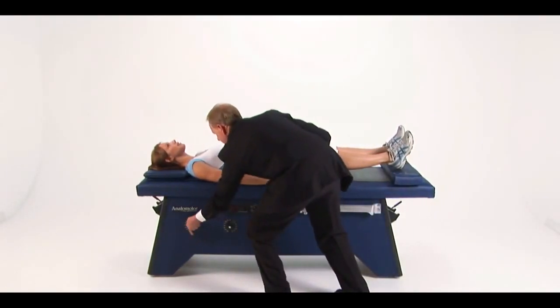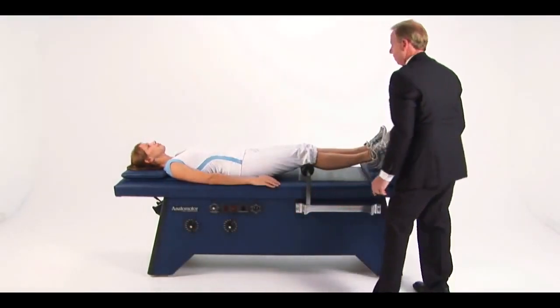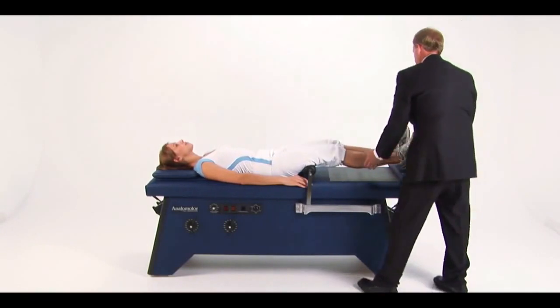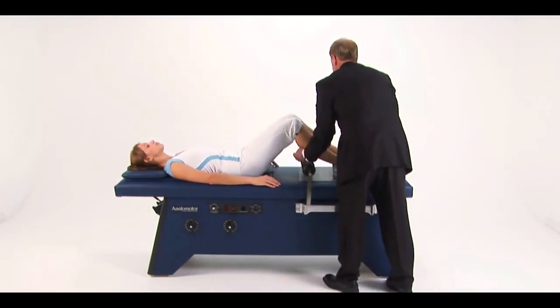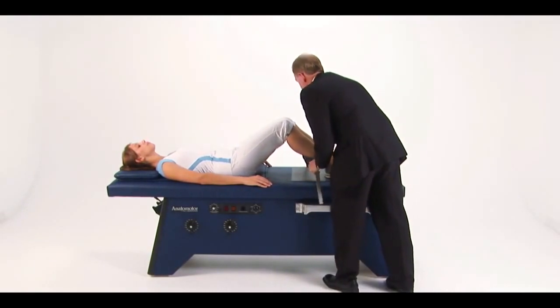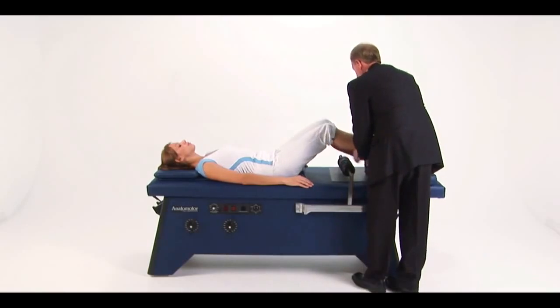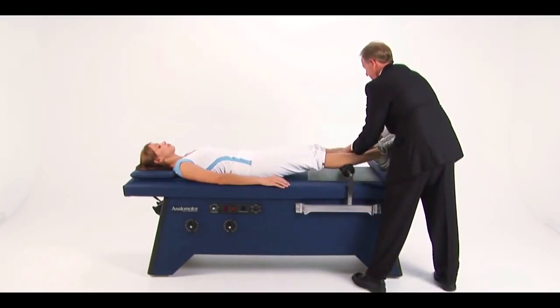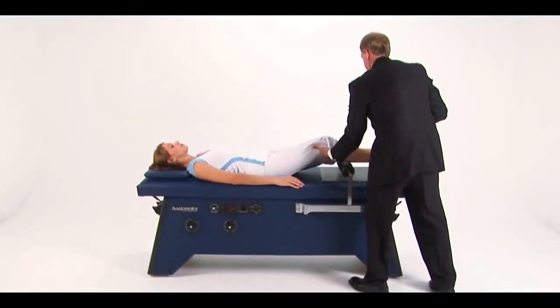Massage of the popliteal space where veins are close to the surface of the skin is not advisable and can be avoided by positioning the patient higher on the table. To reduce the massage pressure on either hamstring or calf areas, simply support the heels with a pillow or the insert block. Leg rollers should not be used on patients with phlebitis, severe varicosity, or any other condition for which deep kneading massage is contraindicated.